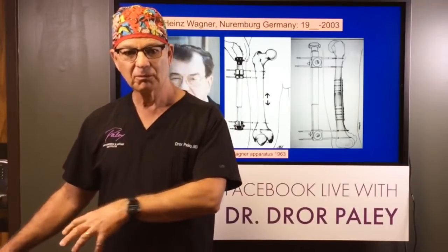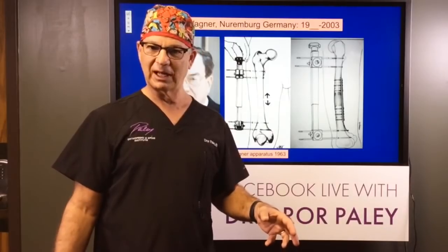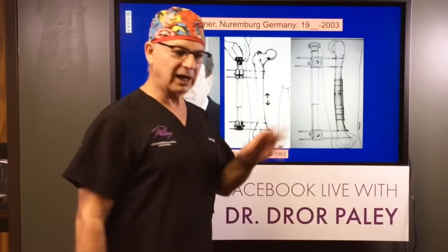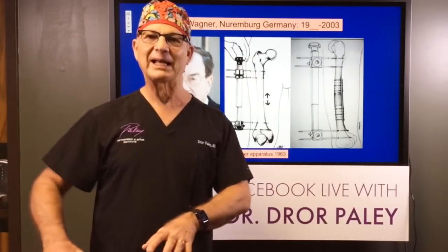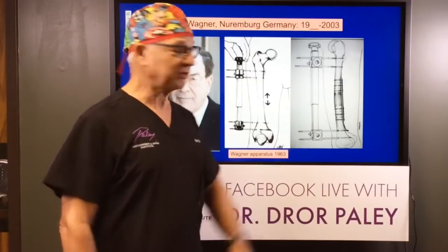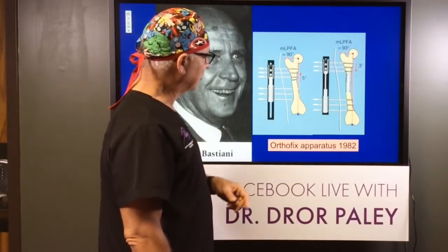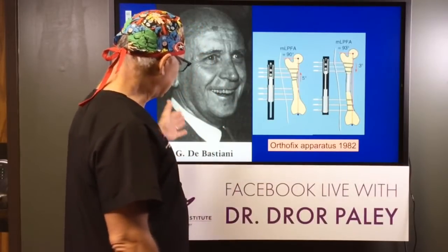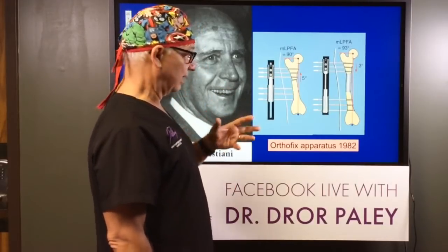All the knowledge until then was bone and muscle formation, and there's 50 years worth of publications on that. And this guy, in trying to speed this whole thing up, set the whole thing back, and everybody forgot everything that was done for 100 years, for 50 years. The next big advance in these monolateral devices was in 1982, again out of Italy, a guy named Bastiani out of Verona, and he developed the Orthofix Device, which is one of the modern devices of limb lengthening.